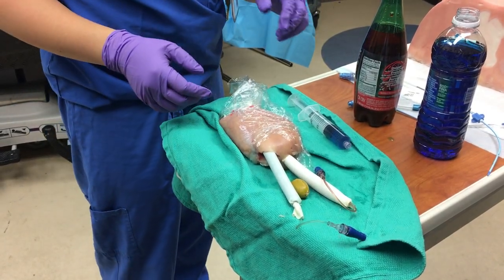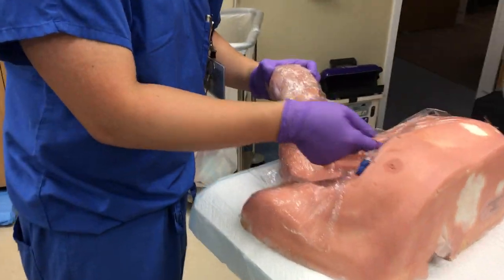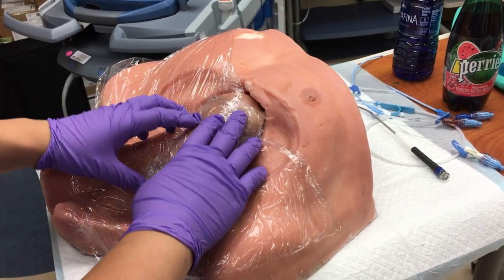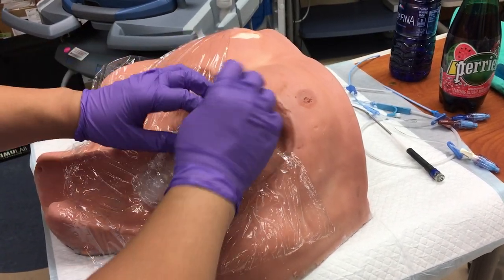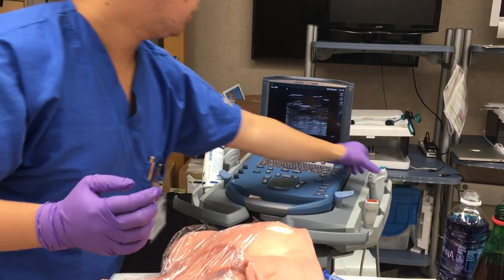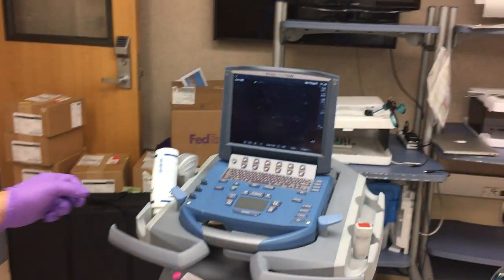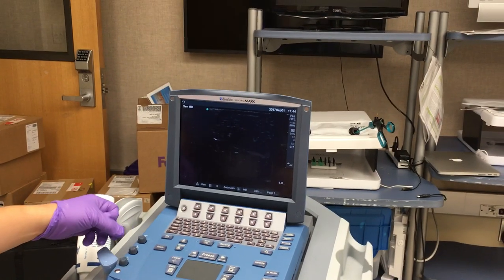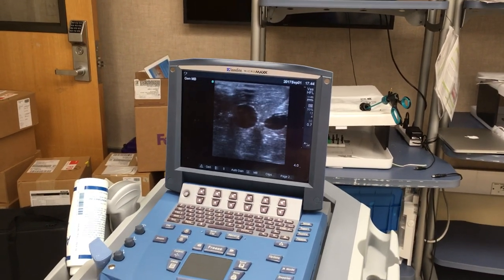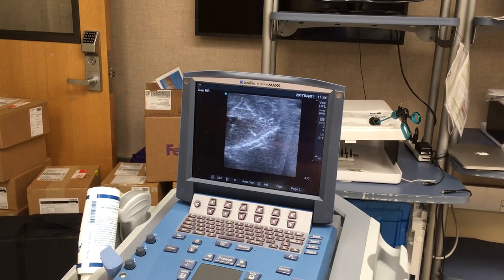The next step is to deploy this into our mannequin — it goes in like so. Our mannequin is lined with saran wrap. We're going to channel the tubing through the hole in the mannequin, and then the chicken breast lays on top like so. One of the highlights of this model is it's very well ultrasoundable. If you look at the ultrasound probe — once I put the ultrasound onto the chicken, you can see that the vessels are clearly visualized and the vein is more compressed.